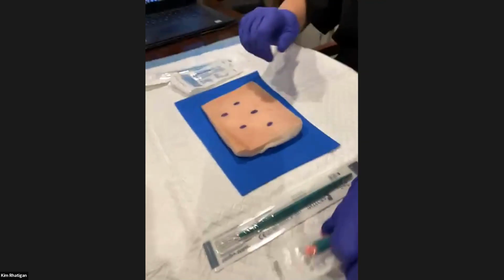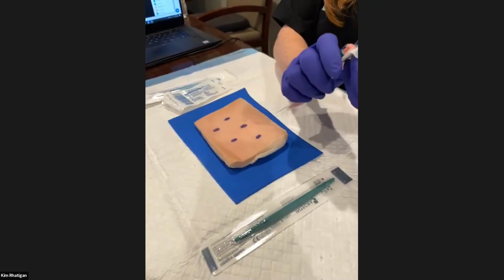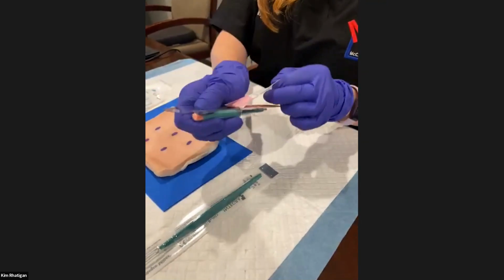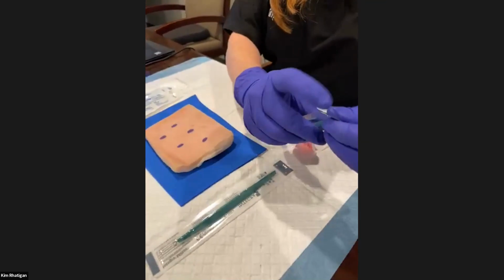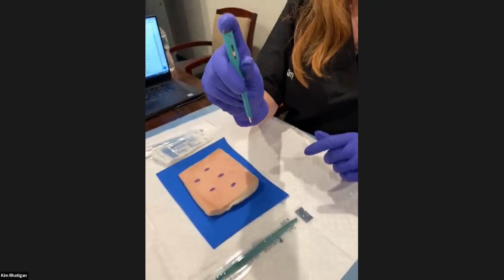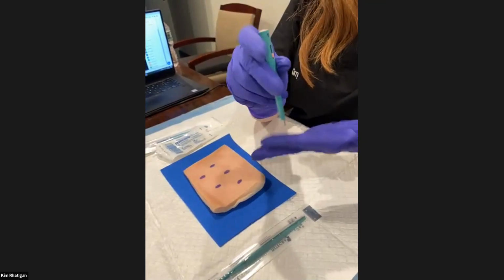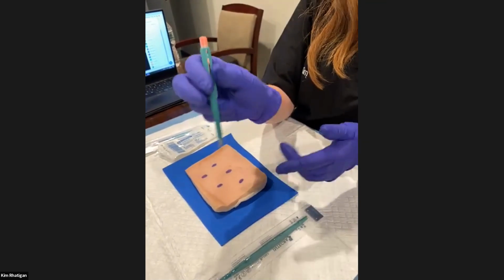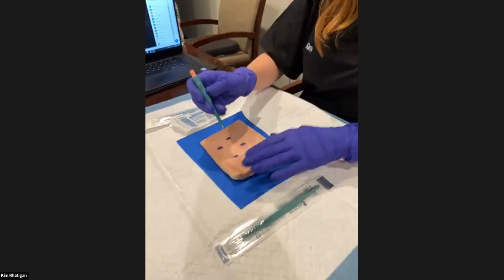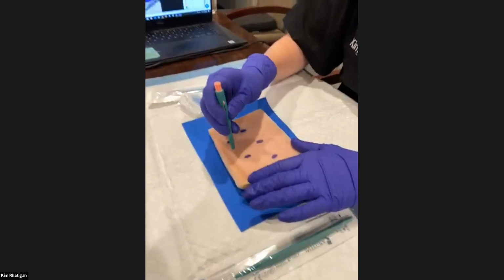So let's begin with the punch biopsy. I'm going to open the punch biopsy. Remember, this is the plunger. When I push the plunger down, it's safe. When I release the plunger, it's sharp. So be very careful with your sharps. Let's do a live punch biopsy.